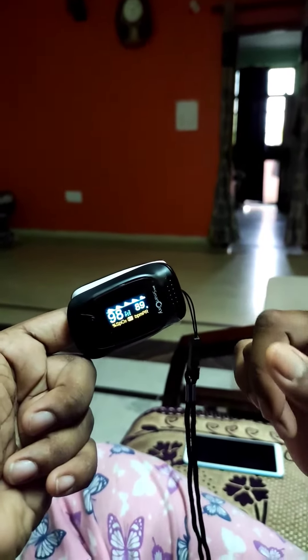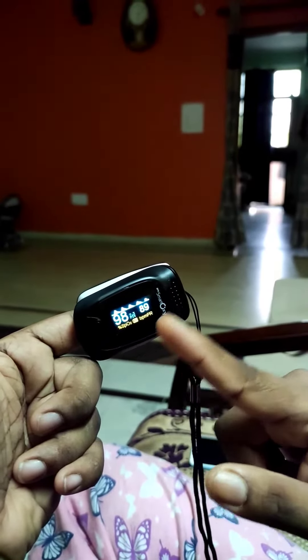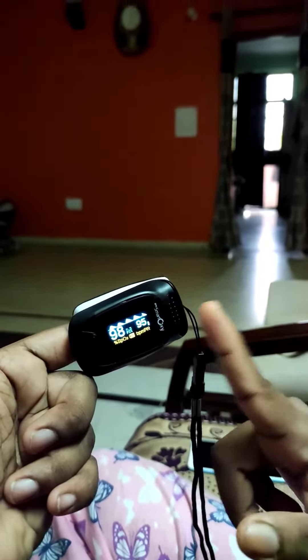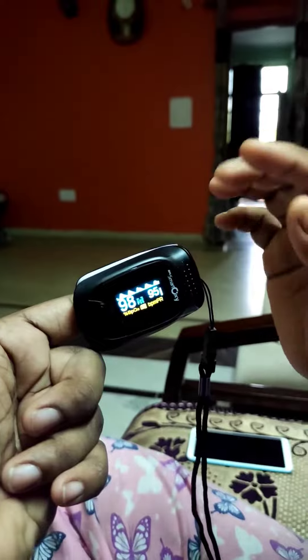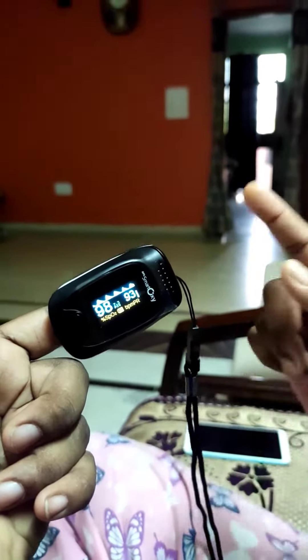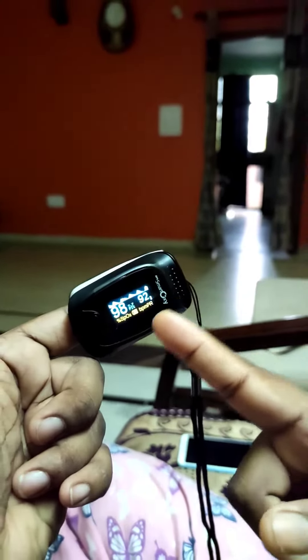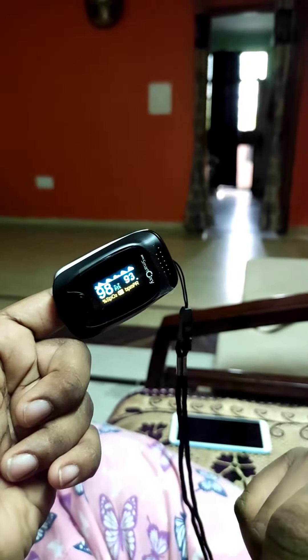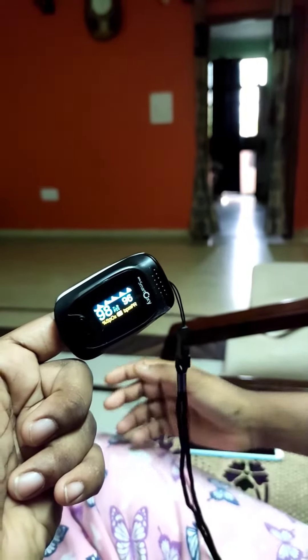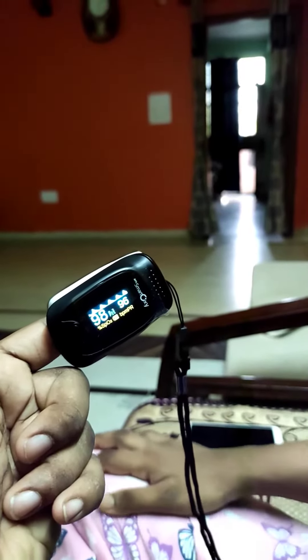This is the pulse rate. To see your oxygen level, look at the percentage SpO2 reading. Keep the machine over your finger for about one minute, and you can see the level of oxygen in your body. It should be more than or equal to 94.